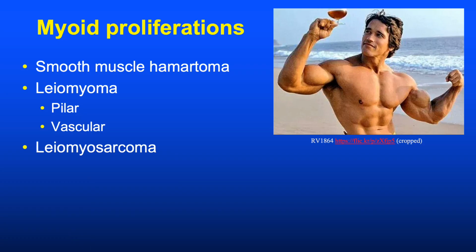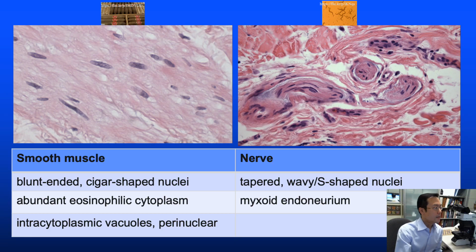And so, as we get closer to the end, I propose that we make the list of disorders even shorter. So we can have a short list, and that's partly facilitated by the fact that in the broad, superficial world of dermatopathology, we can largely get away with skipping skeletal muscle and certainly cardiac muscle tumors, but we do need to deal full on with a wide spectrum of smooth muscle related tumors. And so this is front and center for the differential of spindle cell tumors.